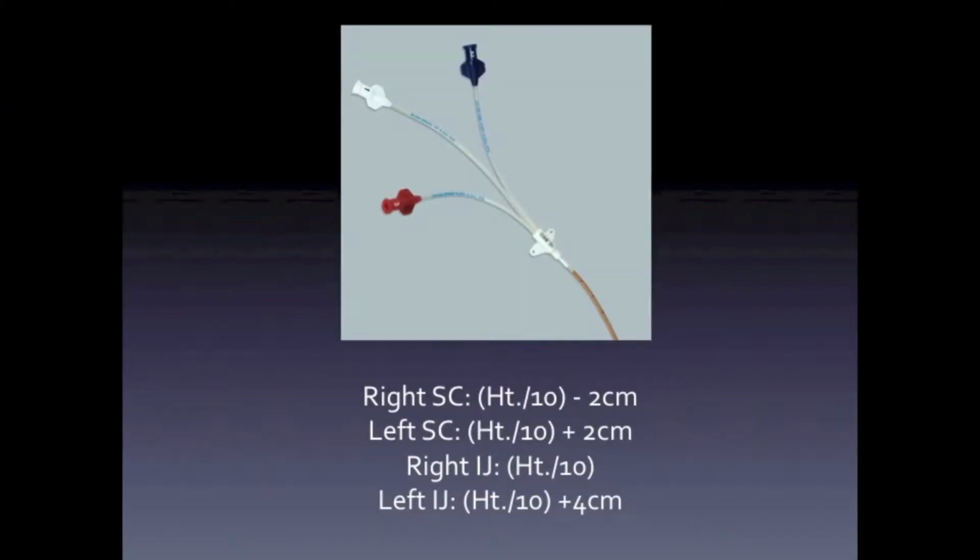The first step in this process is to place the central line to the best of your ability based on procedural guidelines in either the left or right subclavian or internal jugular veins. Be sure to approximate the length of the venous catheter insertion either by using appropriate formulas based on the site or close approximation based on the patient's body habitus. This will ensure that the catheter tip is not placed directly in the atrium.